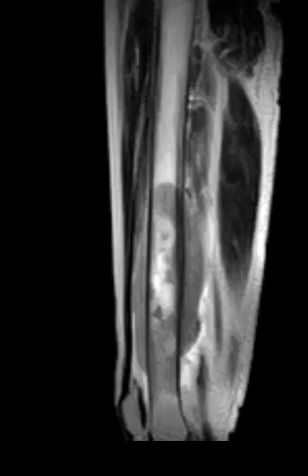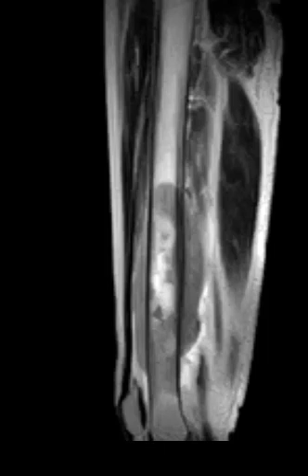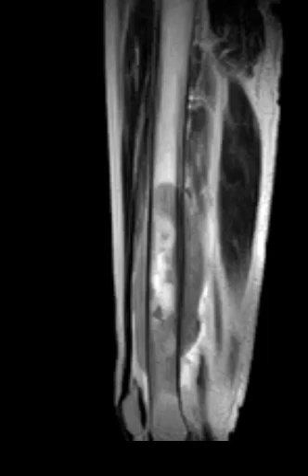Hello, this is Dr. Gay from First Psych MRI, and this is a patient who had complaints of leg swelling. She was an elderly female, and the swelling was gradual, and we did an MRI of the thigh.